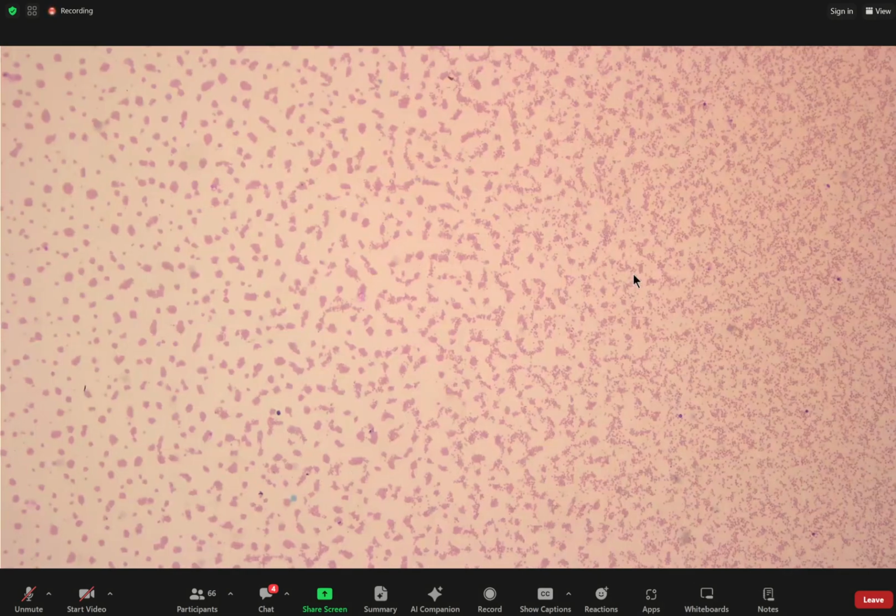So this is the PBF during the bone marrow day. At this time, the patient's Hb was 6.8 with MCV of 90, MCH 26.9. Total white was 2.86 with ANC 1.3 and platelet was normal at 300. On other examination, renal profile was normal. LFT shows reversed albumin globulin ratio.